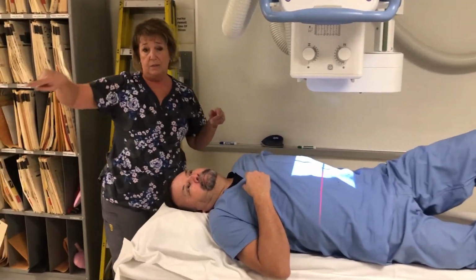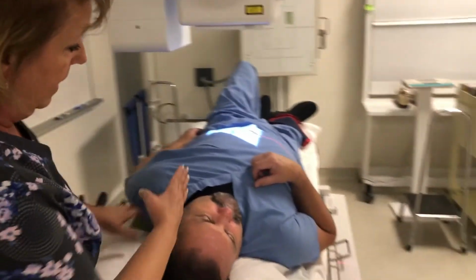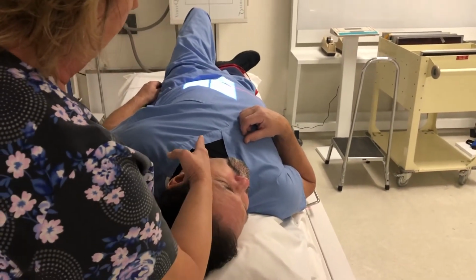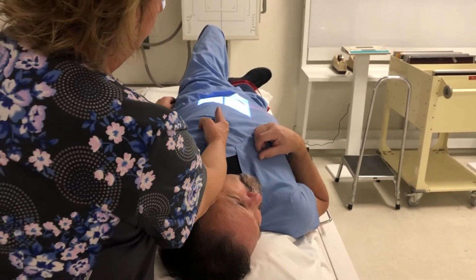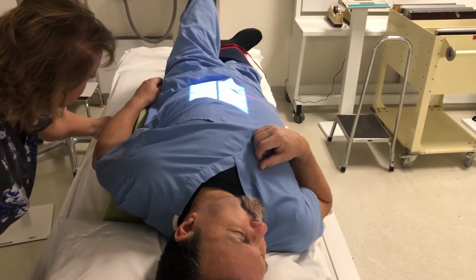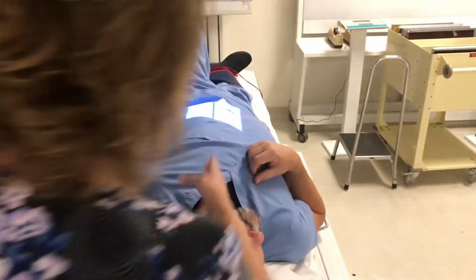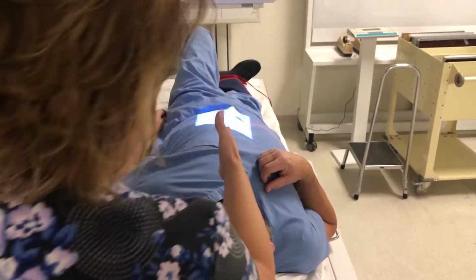Another way you can double check, if you come up here, turn your head just 45, if I imagine where his neck is, and I follow that down, that's also, and I believe maybe he's turned a little bit, that's why this is not lined up. So I follow his neck down, and I'm on his spine.